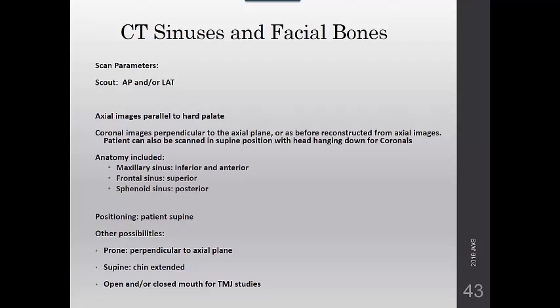Examination of the facial bones should also include axial and coronal images. Scan coverage should be adjusted to the area of interest. It's common in some facilities to not include the mandible when planning the scan if it's not an area of interest, but most facilities, the ones I know of, do include the mandible. Both standard algorithm and bone algorithm reconstructions are necessary to optimally display soft tissue and bony structures.